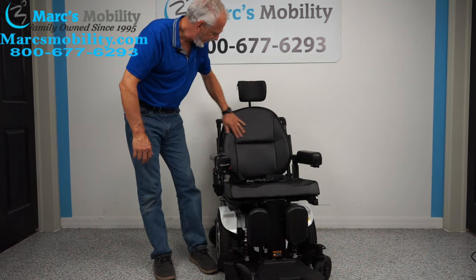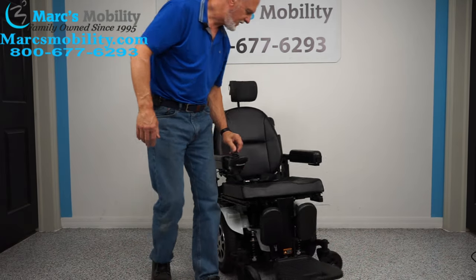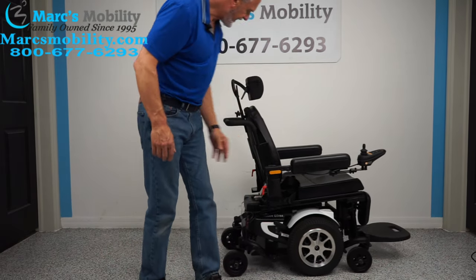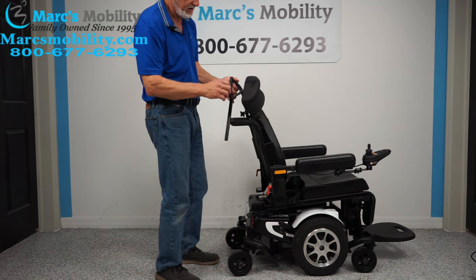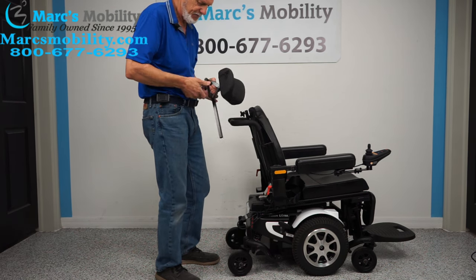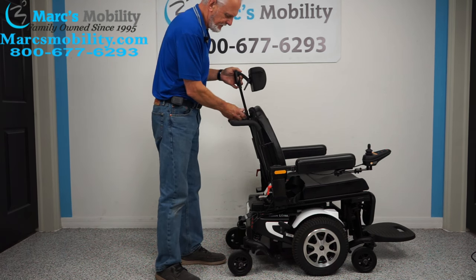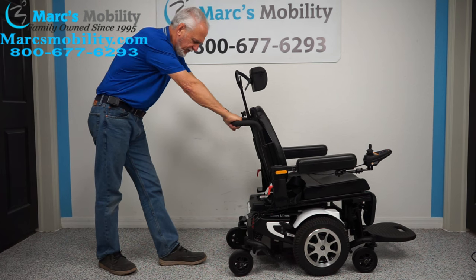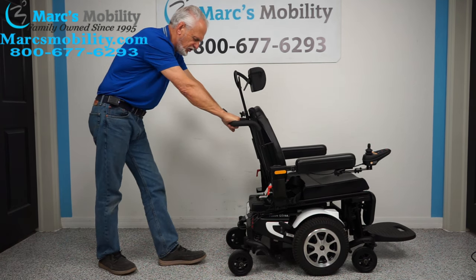It has a nice back — it's not leather, but it feels like leather. You have an adjustable headrest that is removable and has all kinds of adjustments. You have push bars on this chair — the nice thing is it comes with push bars already on the chair.